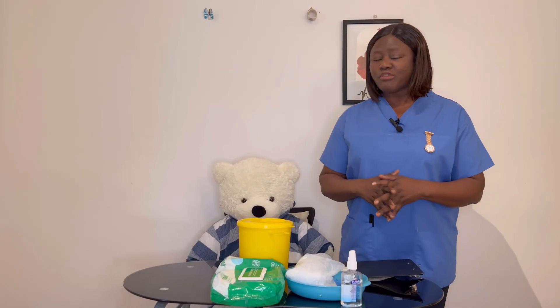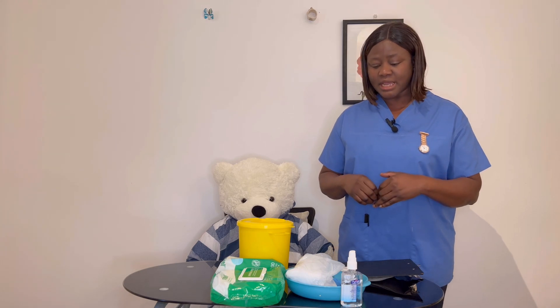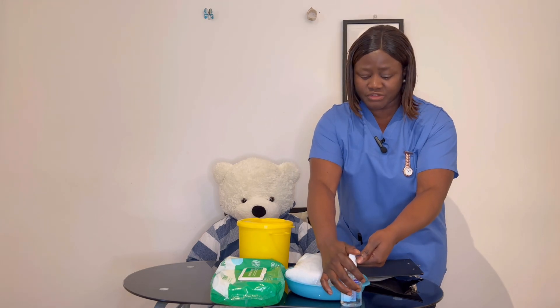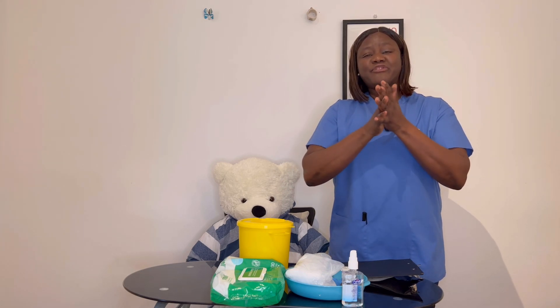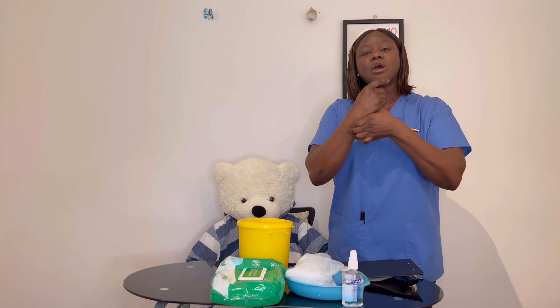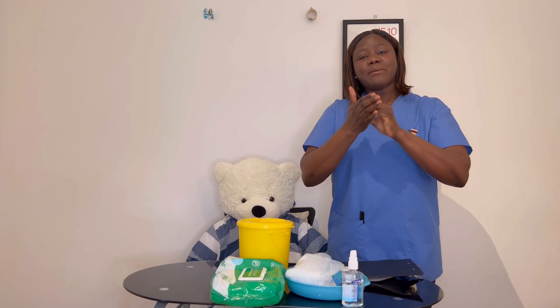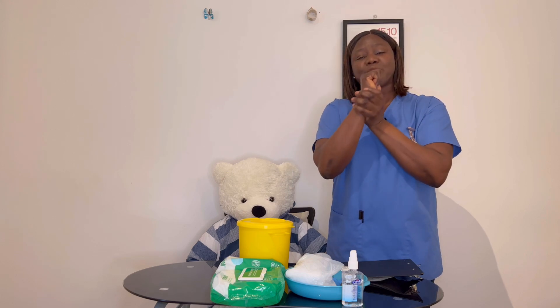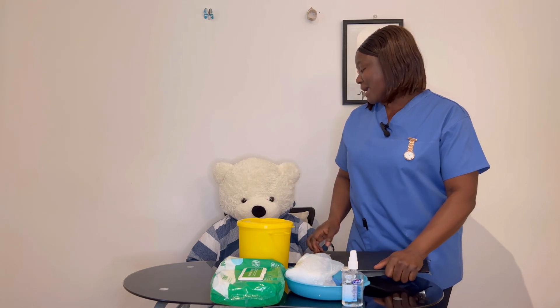As I approach the scene, I can confirm the scene is safe — there is nothing to cause harm to myself or my patient. I go ahead to apply a pump of gel and do my hand hygiene according to WHO standard: palm to palm, palm to back of hand, vice versa, fingers interlaced, fingers interlocked, thumbs in rotational manner, fingers in rotational manner, wrists in rotational manner. I allow my hands to dry for 30 seconds as I approach my patient.